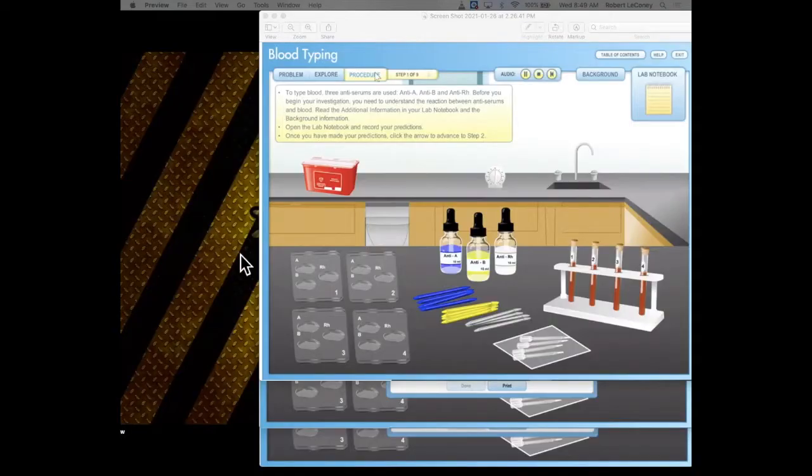Let's take a look at the lab that you're going to do today. Now, this is a screenshot of the actual lab. Unfortunately, we will not be able to do a hands-on version of this because this was based off Flash animation, which has gone obsolete. I am sorry for that. So unfortunately, we're going to have to watch a video of me running through it for you until I'm able to find a suitable replacement.